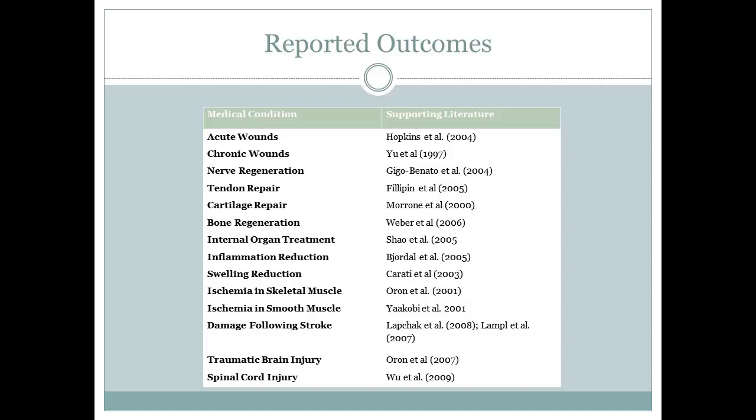But ultimately, if all of these elements are happening, and we are seeing the profound effects of the EML device or a similar output parameter of laser energy, we're seeing the profound transformation of tissue quality, tissue structure, then we begin to understand how it's able to affect acute and chronic pain by activating the same photoreceptor and changing the same signal cascade or secondary cascade within cell structures as observed in these studies. We're seeing these changes, and this allows us to appreciate and understand how this therapy could serve as a viable solution for acute and chronic pain.